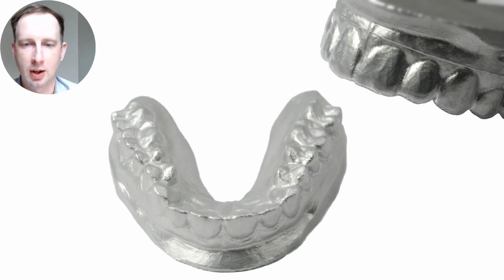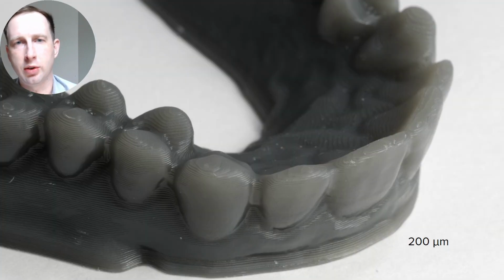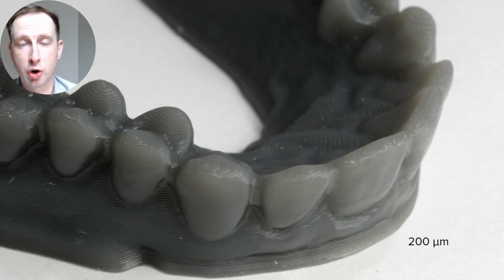And okay, we'll see. To dig a little bit into the process, when we do dental applications and validation and testing, we use master models. We used to do stone, but stone gets worn out and changes, so we switched to metal master models. And what we do is we print these master models in all sorts of orientations and positions to check fit and accuracy and everything else, not just in 3D scanning and comparison, but also the physical making of these appliances. How does it fit back to the master model, right? And we do many other tests as well, like for print reliability, we'll do really small, thin models, but this is really for tuning and making sure it's meeting our spec at a high level.